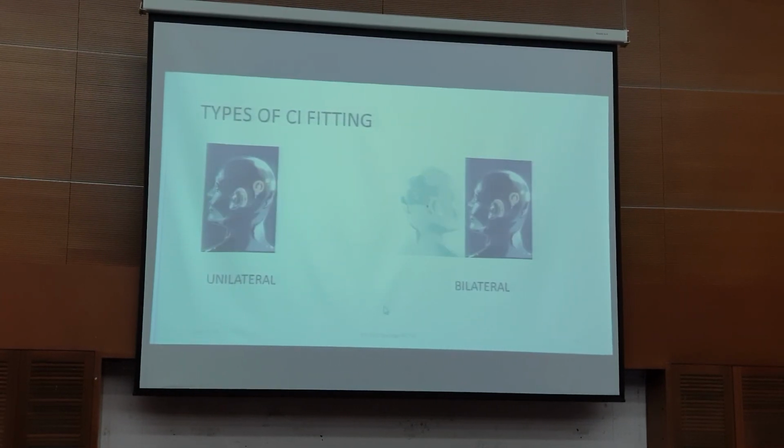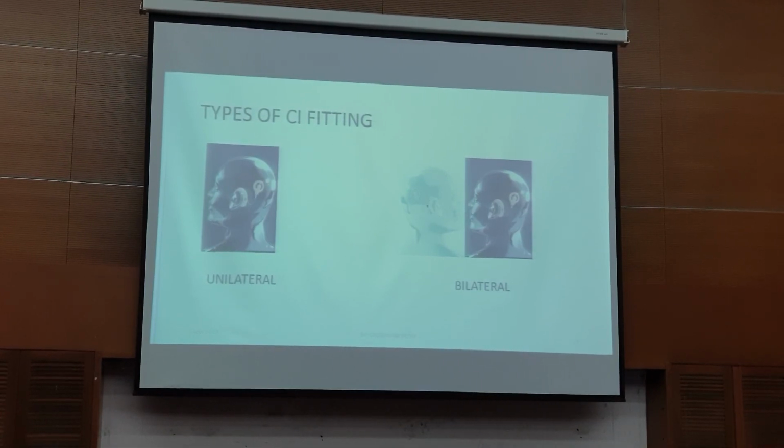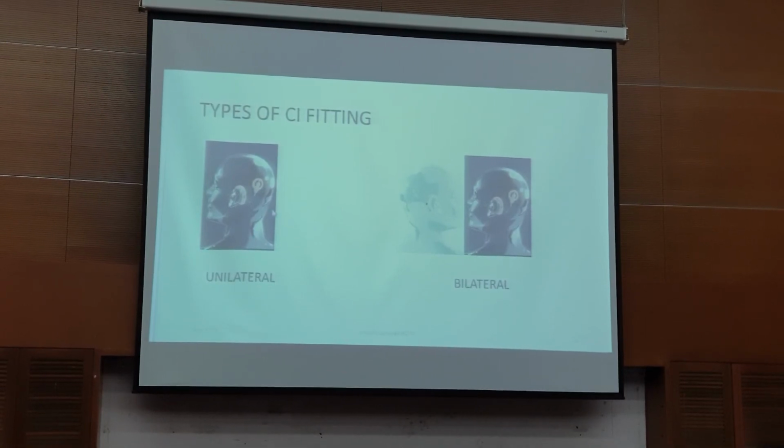And then the types of fitting. It can be unilateral. Most of our cases, in the first 10 years when we first started, were unilateral users because the hearing loss was very profound. We only implanted those with very profound losses, so they could not benefit from hearing aids.